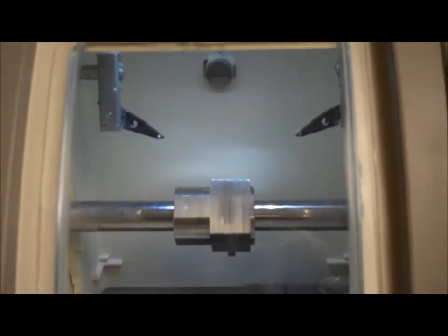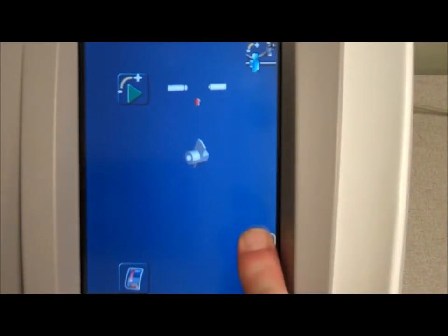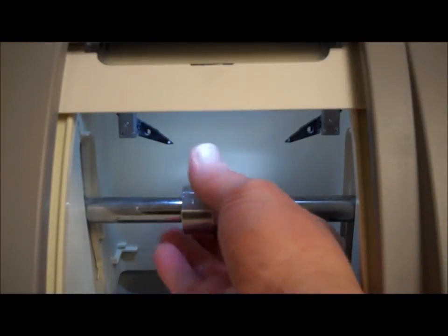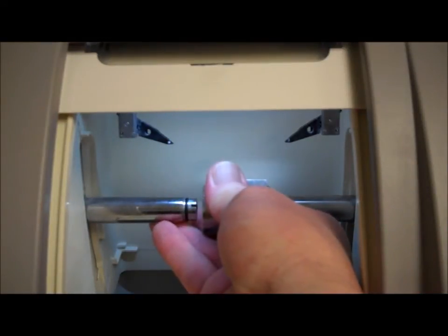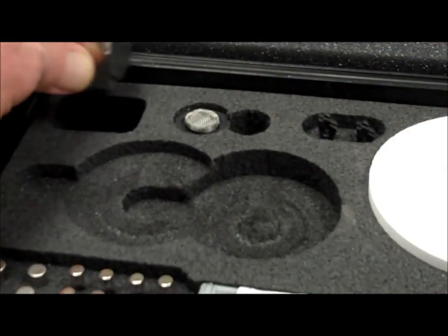When the calibration process is complete, select the unclamp icon to disengage the clamping shaft from the tool. Remove the calibration tool from the clamp shaft. Return your calibration tool to your accessories kit.